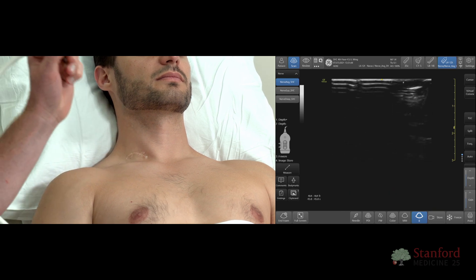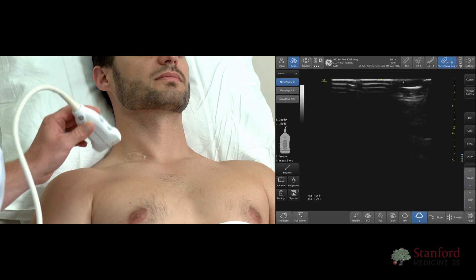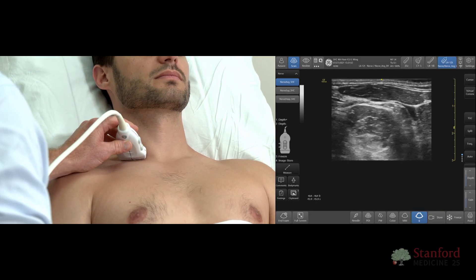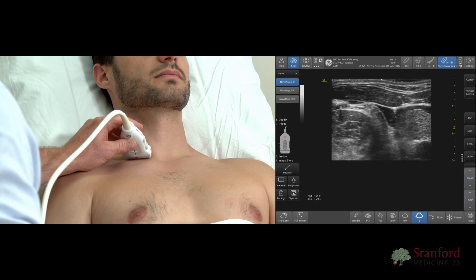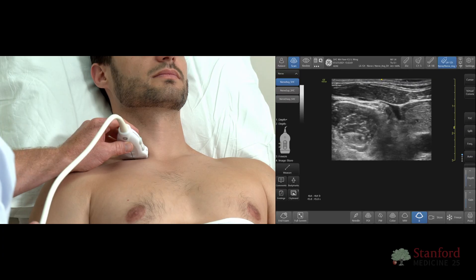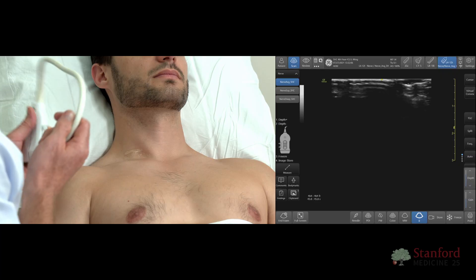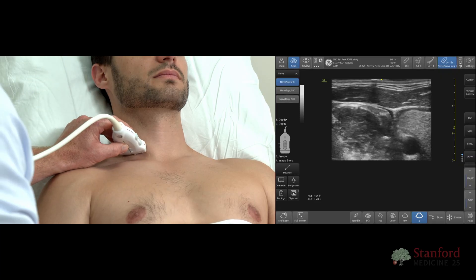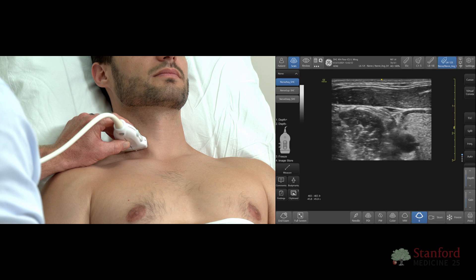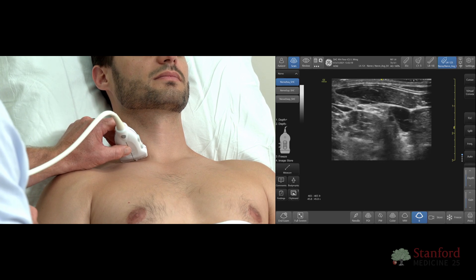The challenge with this exam — the only technically difficult part — is that even light pressure with my probe will collapse the vein, and that's not telling you what you want to know. Here's light pressure, and now watch what happens when I push. Now it looks like it's totally collapsed again, but that's me pressing too hard. When you go to do this exam, this is where you can mess it up. You need to have gentle, gentle pressure — even the lightest pressure can totally collapse the vein. As we move up, his vein is totally collapsed, and then as we come down, we can see it's nice and open.